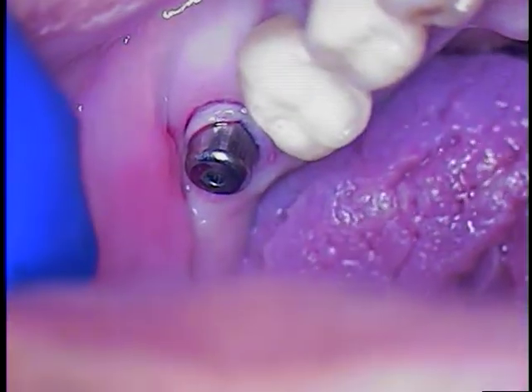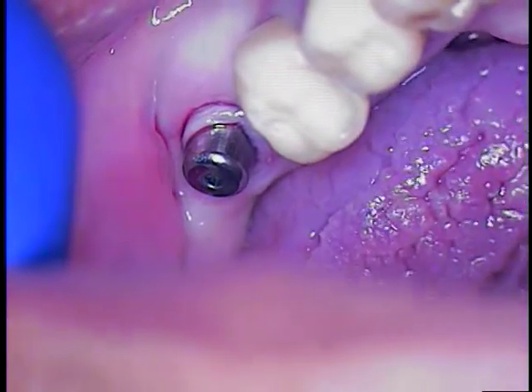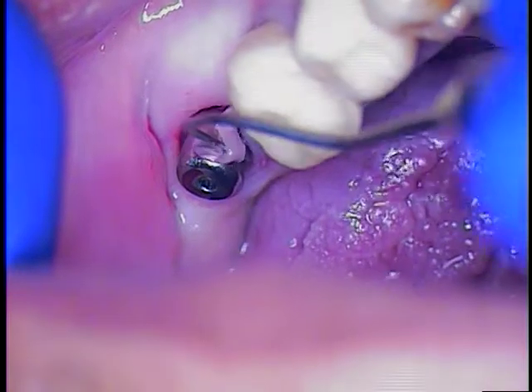There it is. So now we take either an explorer or any type of instrument, we'll just lift that out, and we're going to use our little suction.